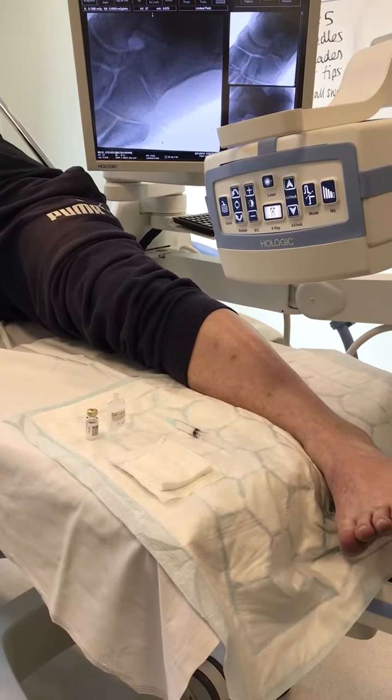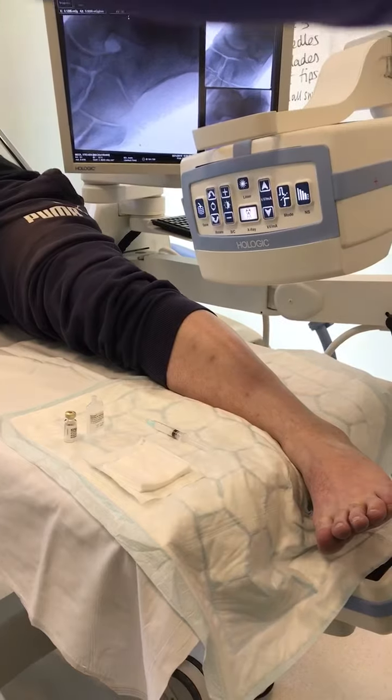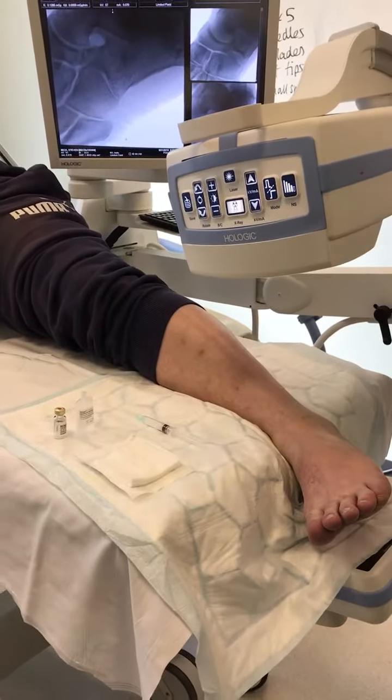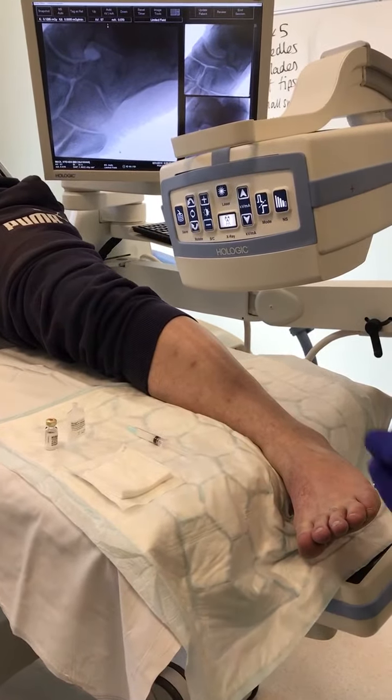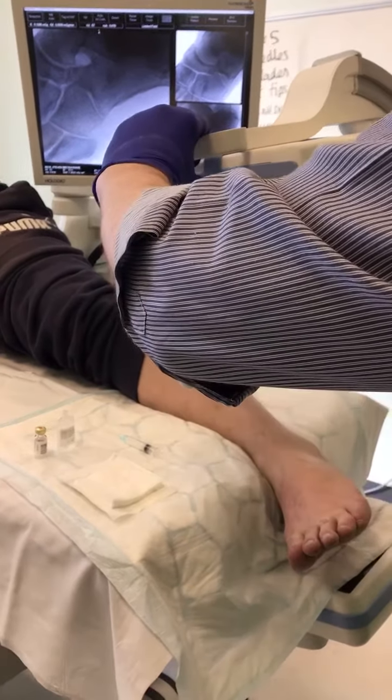Keep the camera nice and steady because it's one thing on YouTube they really hate is when you see a lot of this. So this young guy has got a calcaneo-navicular coalition.